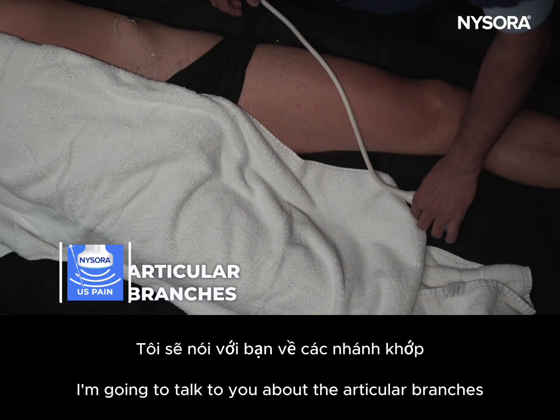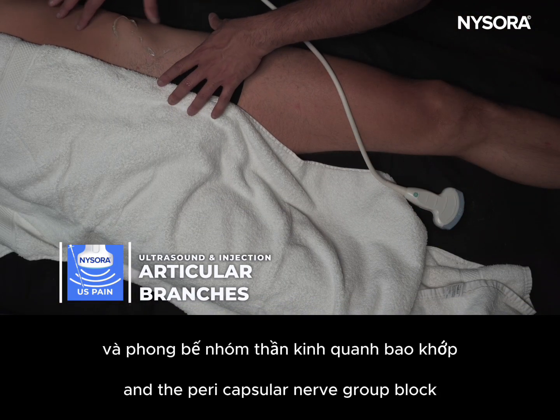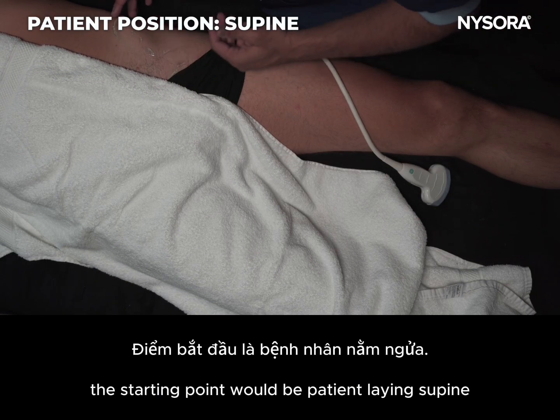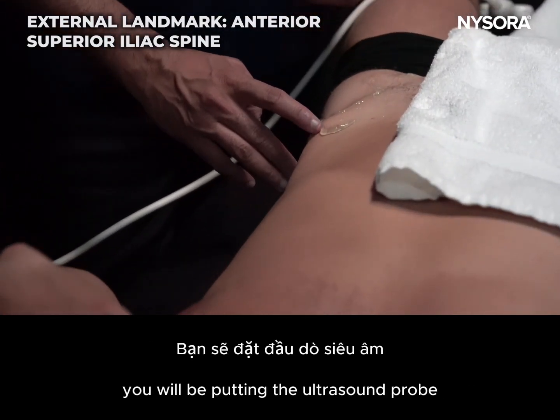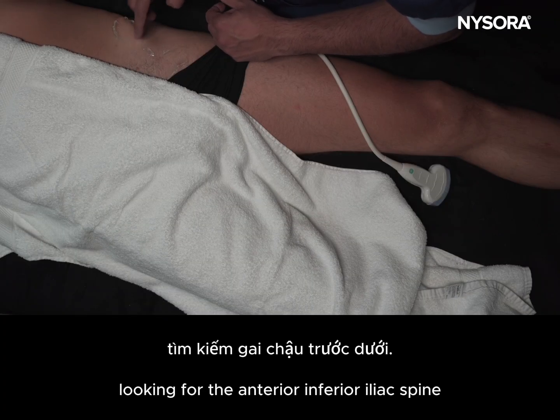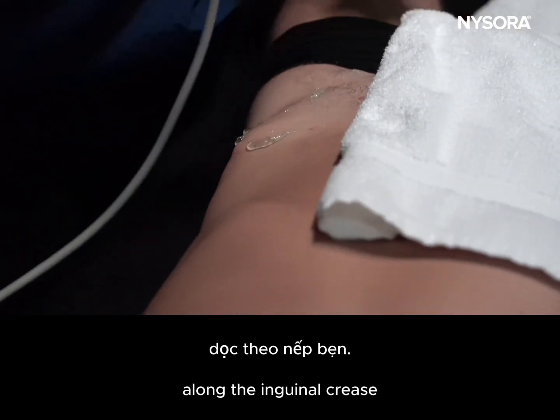I'm going to talk to you about the articular branches and the pericapsular nerve group block for hip joint pain. The starting point would be the patient lying supine. Palpate the anterior superior iliac spine. You will be putting the ultrasound probe at the anterior superior iliac spine and moving down, looking for the anterior inferior iliac spine, and moving the ultrasound probe along the inguinal crease.